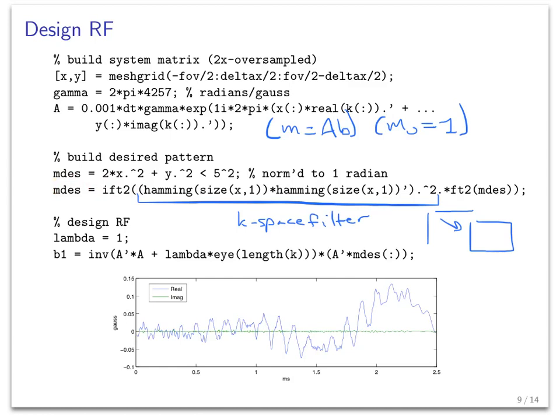So then I design the RF, and I do that. I'm going to use a little bit of regularization here. So I just pulled this number out of thin air. I'm using lambda equals 1 here. So this is the RF power regularization that we talked about earlier.